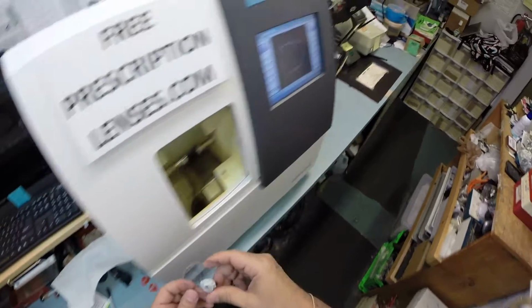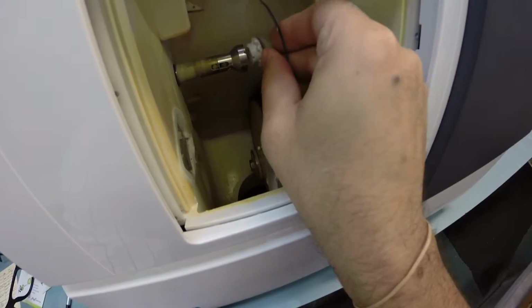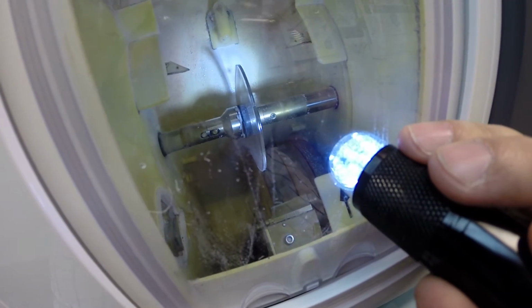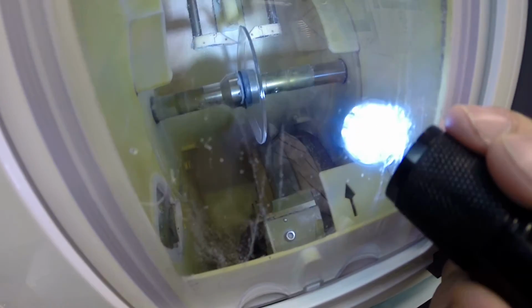We're going to go ahead and start cutting the left lens. We're going to flip that over to L. Make sure the magnet lines up on top. And then hit the start button. Just like before, the door closes, the clamp shuts. And then the lens is going to be traced by the two white styluses, making sure that it's large enough to fit into the frame.